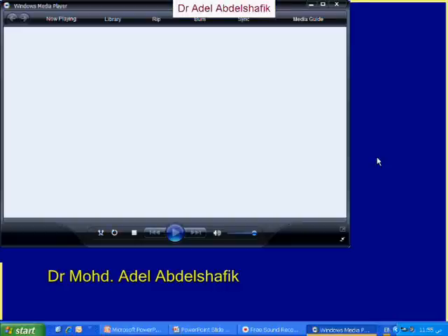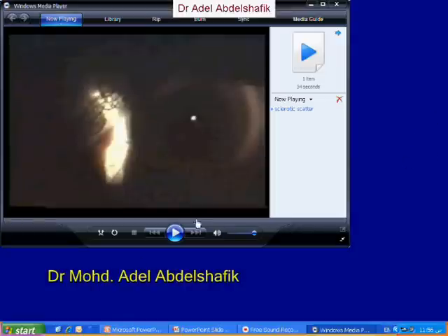Okay, now another video, another method. I want you to see what's going on here. You see the light is on one side of the limbus, but the opposite part of the limbus is illuminated. So in this method, we are not focusing the light on the same location of the slit lamp. We unlocked the lock that keeps the light and microscope in the same position, and we see what's going on. Here, the light is opposite. This is the normal eye.